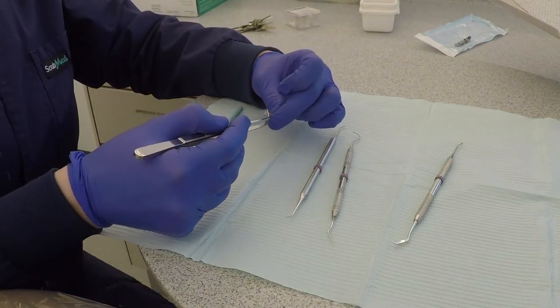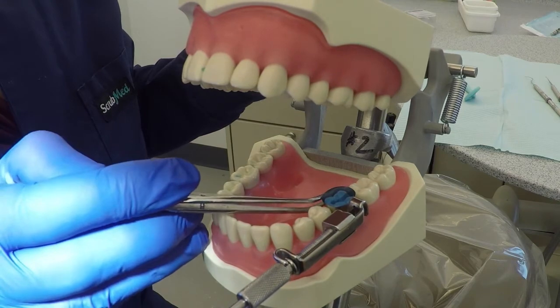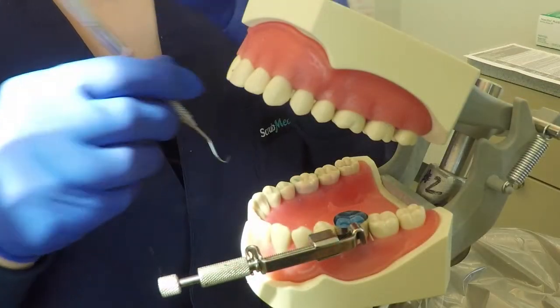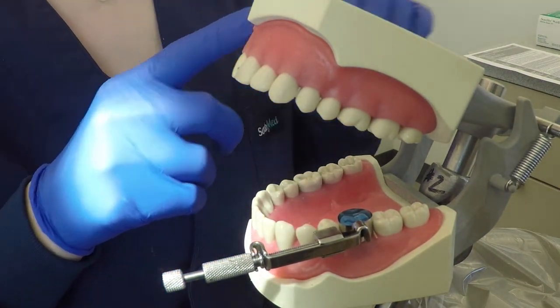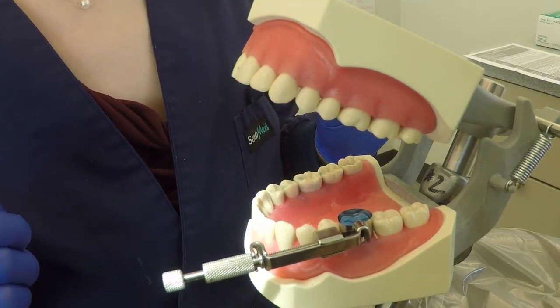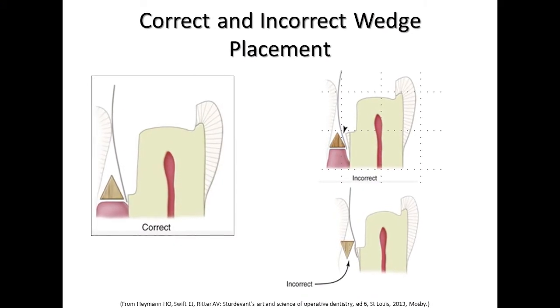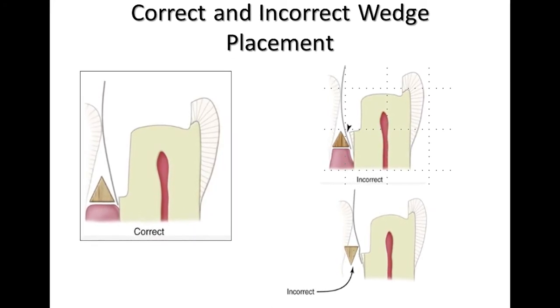Use cotton forceps or cotton pliers to place the wedge — another option is the 110 pliers or Howe pliers. Use the back side of the cotton forcep to press the wedge into place. After the wedge has been placed, check the gingival margin with an explorer to ensure there is a tight seal. The goal is to create a seamless transition where the tooth and the restoration meet. Improper band or wedge placement can result in overhangs.